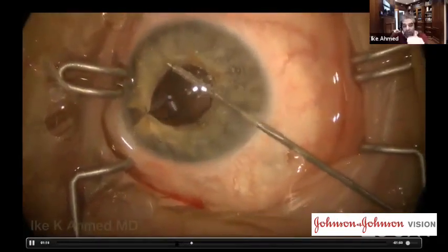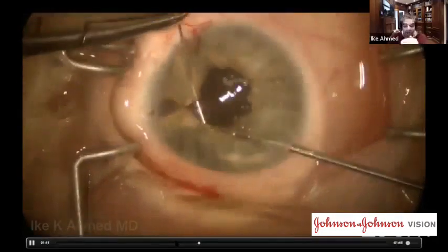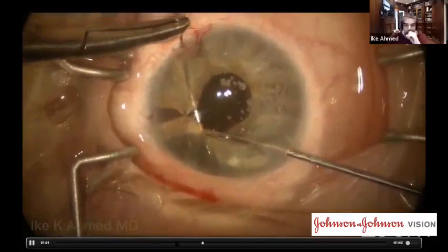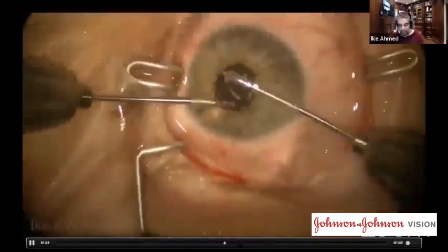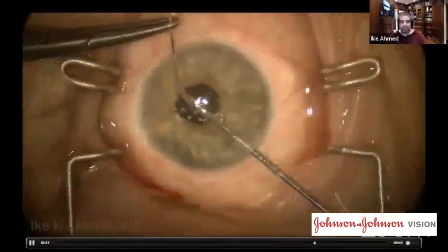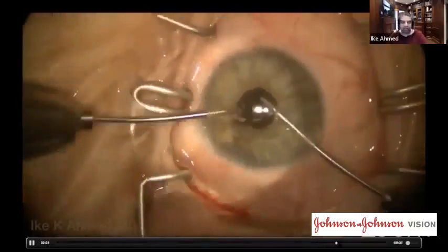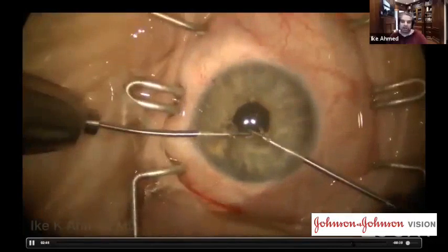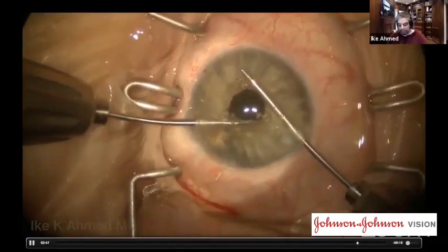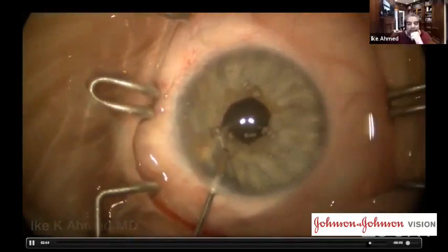When you have finished your pupilloplasty and the pupil looks straight at an edge, take the small cautery and round it out. This will create, again, a more cosmetically pleasing pupil, which I think to our patients is very important. And you can see we just closed that defect, but you'll notice that there's still a bit of a straight edge present on the temporal side. After I lock the knot, I'm going to place a little bit of cautery just in the area temporally, as you'll see here, to create a nice round pupil. So that's one option you can do.